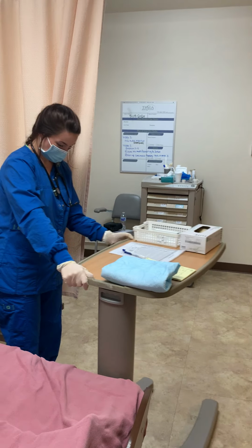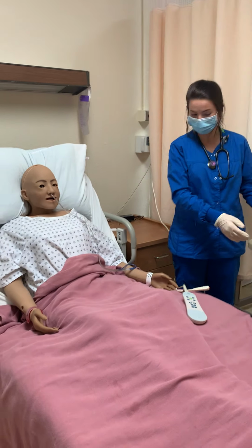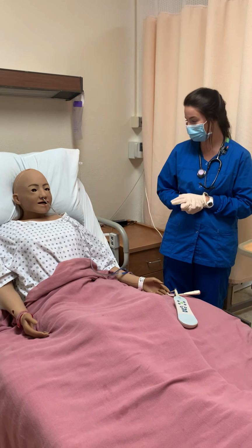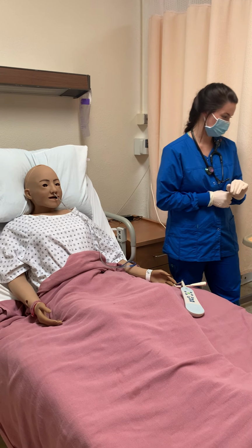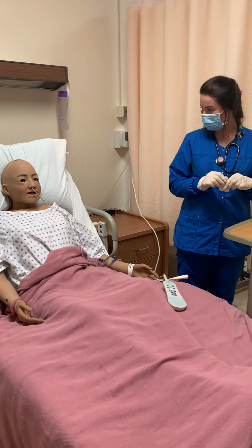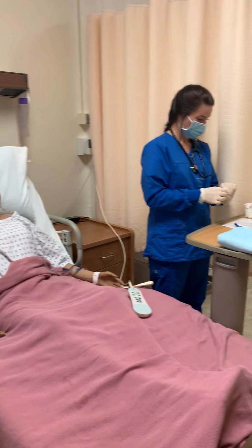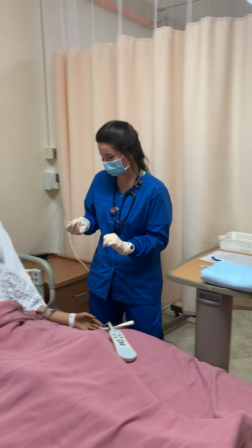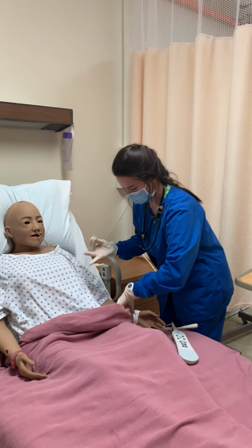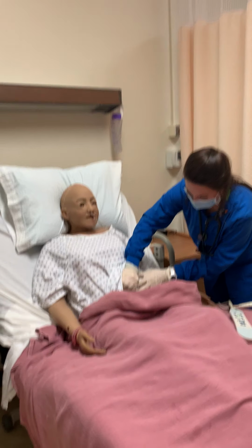And then now that I'm here, Joanne, on a scale from 0 to 10, 0 being no pain, 10 being the worst pain, what would you rate your pain right now? 0. I have no pain. Okay, perfect. Is it okay if we go ahead and do your injection first? Yeah, let's do it. Okay, perfect. And then is it okay if we give it to you in your tummy? Yes, please. Great. So I'm just going to take my alcohol swab here and then just swab off her stomach.